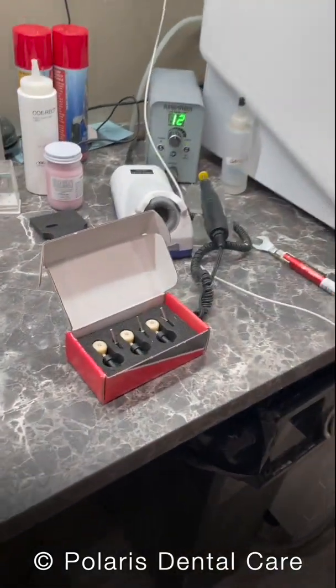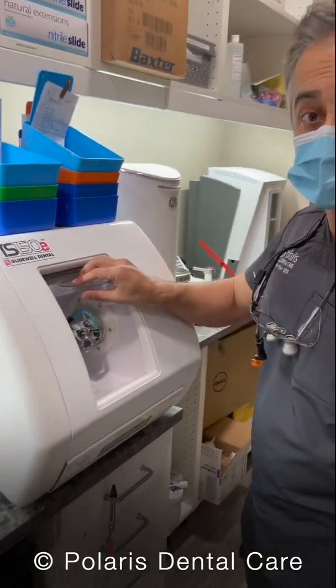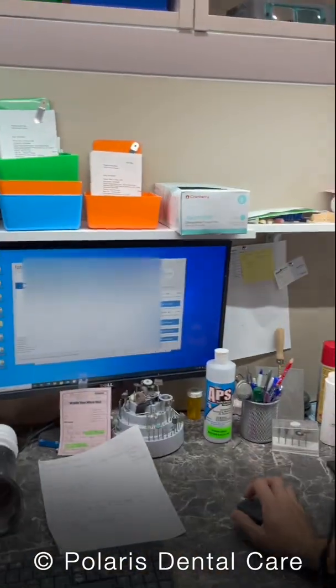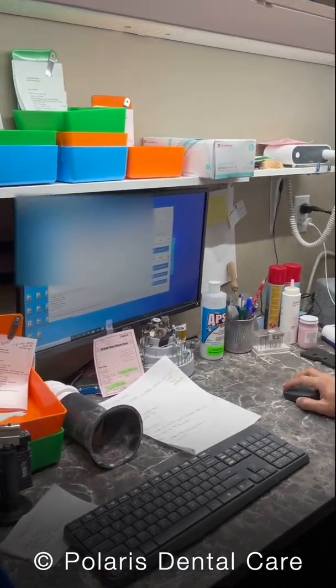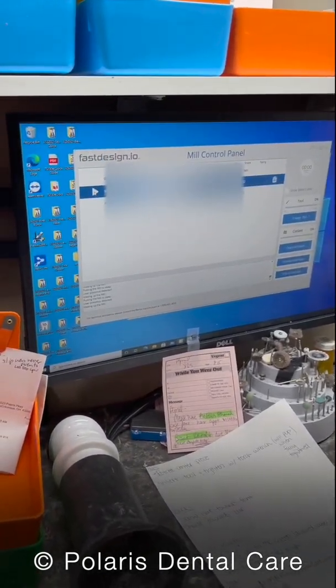The burrs and the blocks go inside this machine right here. First thing on our schedule, we're going to have our patients and we need to go ahead and mill. On the mill control panel, when you find your patients that are ready to mill, you hit the play button right here.